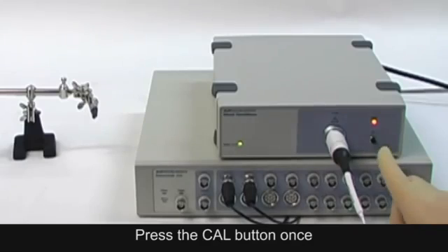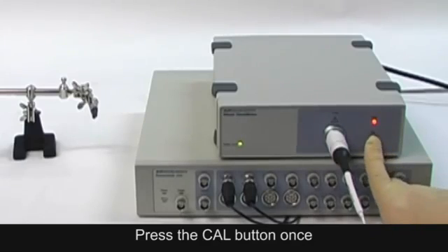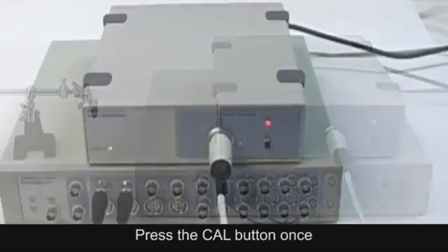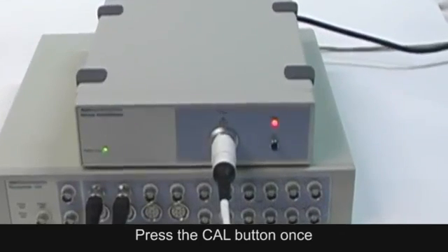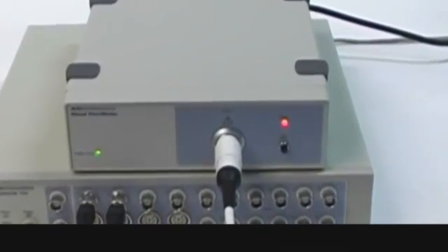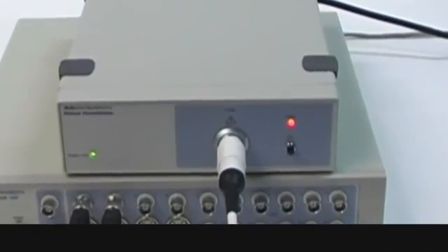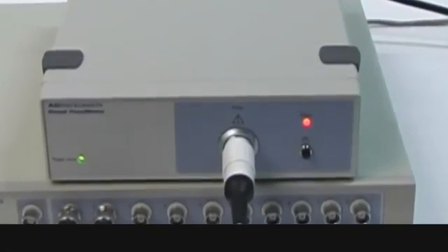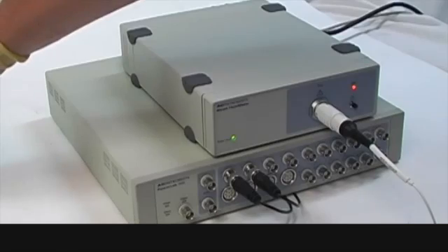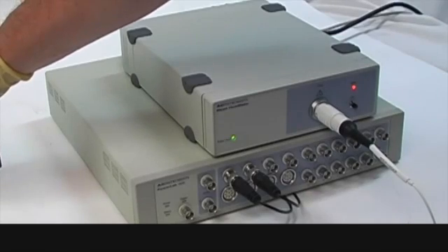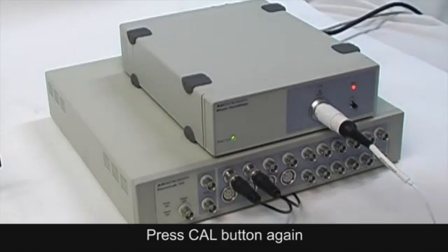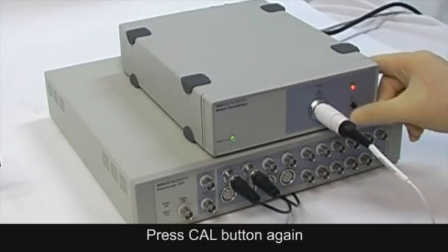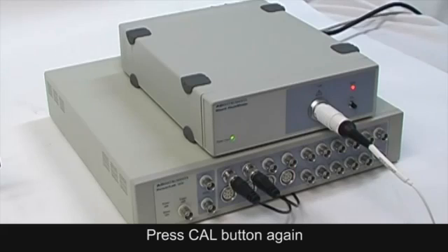While the sensor is immersed in the calibration solution, press the CAL button once. A single beep is emitted, followed by a series of double beeps that continue for approximately 10 seconds. During this 10 second period, press the CAL button again.